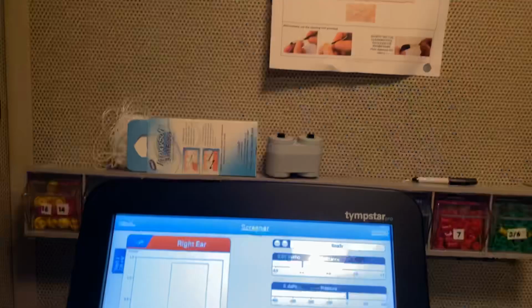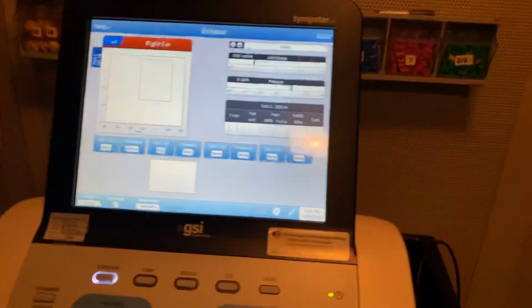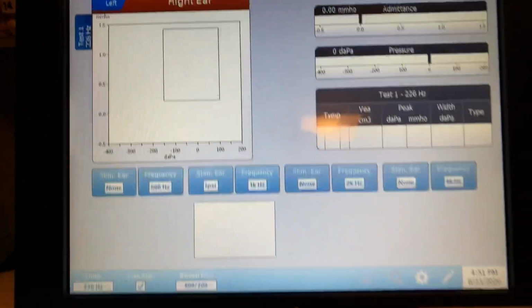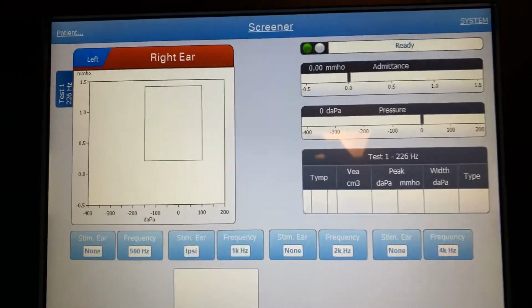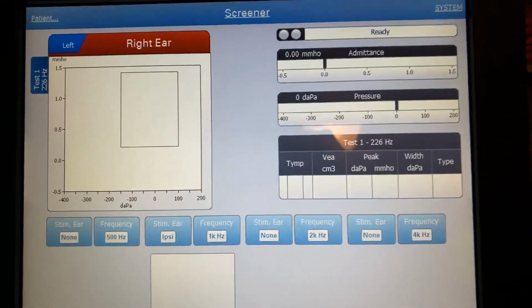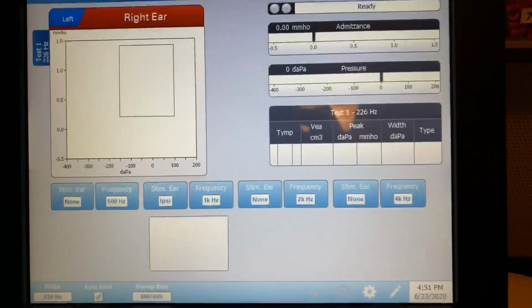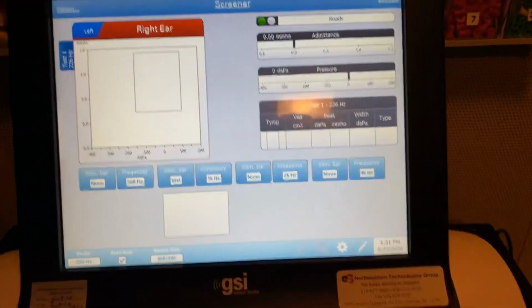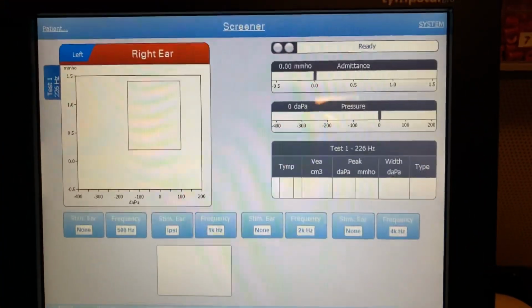Now I'm going to flip this around to the other side. This is a tympanometer. This is the Tymps Pro. I don't really relish doing this on myself, but I'm going to. I'm going to flip it back around. So this is me. I've got this device on my shoulder. Do you see? And we put a probe tip on it. I put the probe tip into my ear. I hear a hum of about 226 hertz. And if I can get this in just right, error leak detected, of course. And now that I'm actually on camera, I can't get this to go. I need a second person, one to hold the camera and one to get this in my ears.